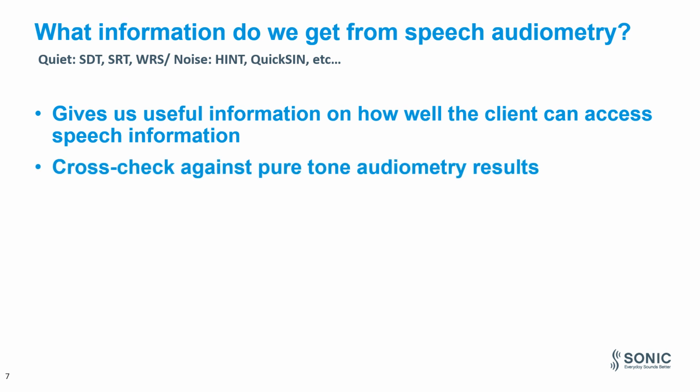Second, it allows us to cross-check or compare with the pure tone audiometry test results. So if the PTA shows a mild hearing loss, but the speech audiometry test shows very poor speech understanding, it does not correlate because the client might be giving fake responses.